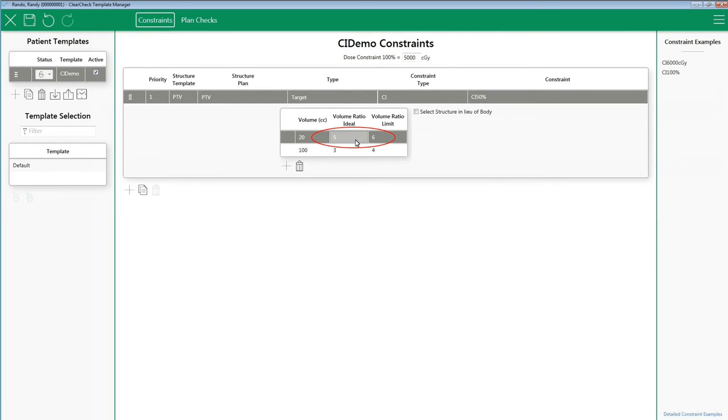In ClearCheck, this will be the first row on the table. Note, the software will not do a linear interpolation from 0 CC. Linear interpolations only happen between volume CC rows and columns that have been built into the table.